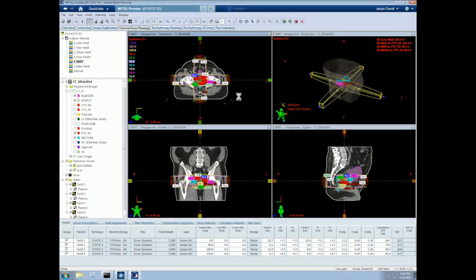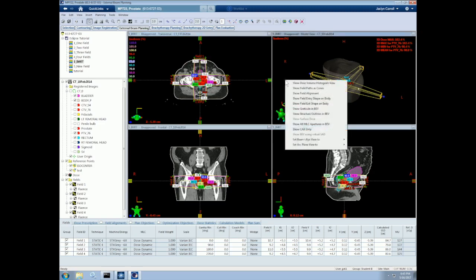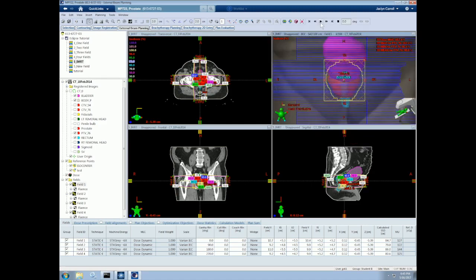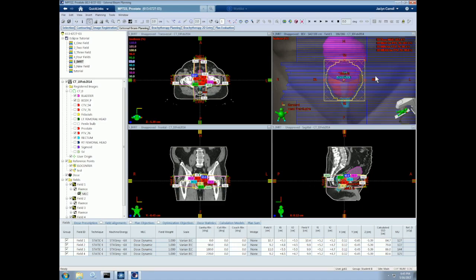Now that the dose has been calculated, our planning system has matched the physical parameters of the machine to try to get as close to the optimal fluence map as possible. And here we have our optimized dose distribution. Since we have an IMRT plan, when we go to the beam's eye view, we can visualize the modulated leaf positions. We can click on play, and you'll see how the MLCs progress throughout the duration of the treatment. This is helpful to ensure that the software did not do anything weird when optimizing and that our target is in the MLC openings for the duration of the beam.